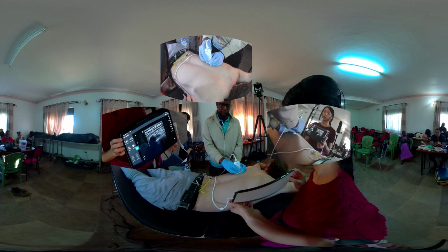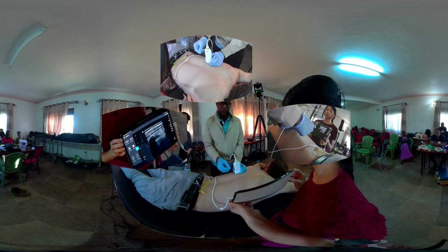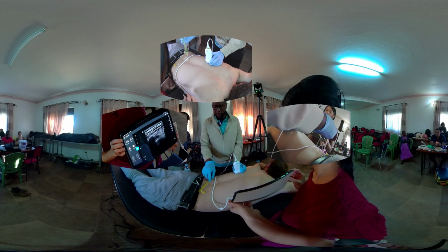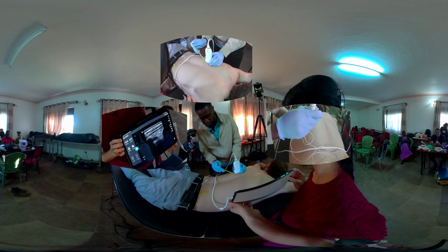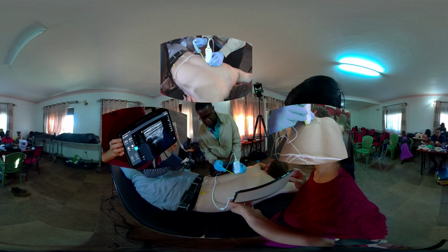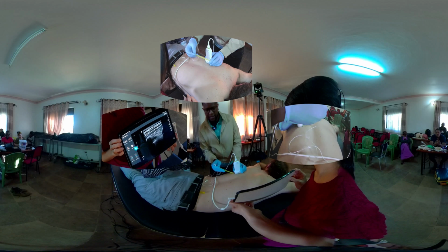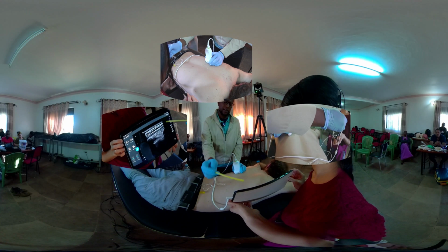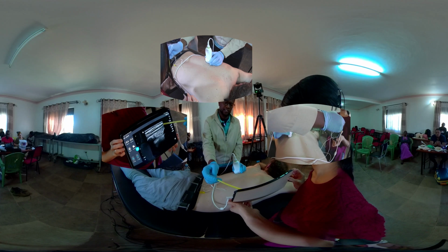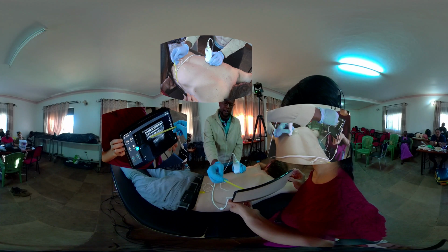Okay, let's optimize our image again. Okay. So your needle will be coming in from the caudal aspects and about half a centimeter away from the probe. Introduce it in that manner, and you should see the needle coming from the right side of the screen in this case, and you are trying to aim for the upper part.